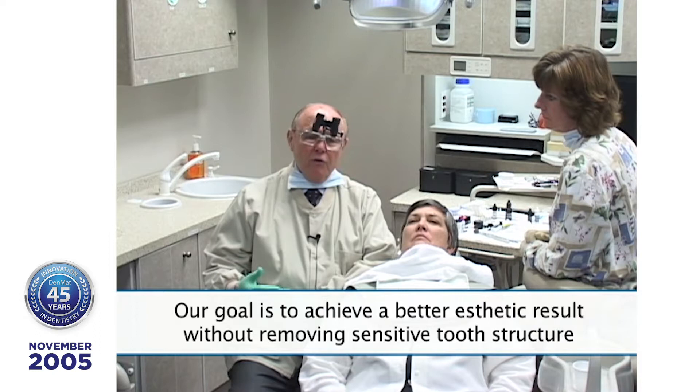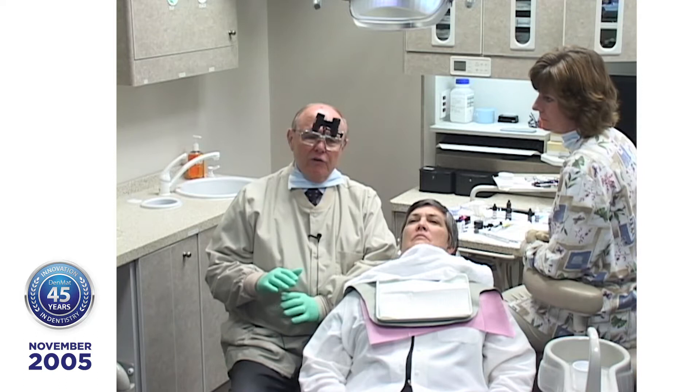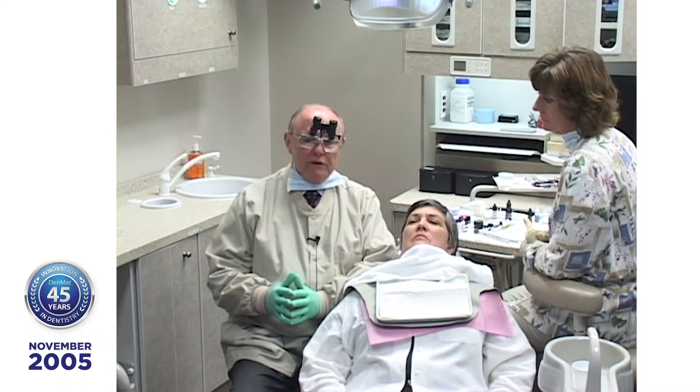When you're working with the Lumineer system, you don't have to remove even a half millimeter of tooth structure. On most patients I'll remove some enamel, but it's cosmetic contouring. The guide I have is: what I remove makes them look better, so even if we never went forward, they would look better. You take away what is in the best cosmetic interest of the patient, not because you're going to build something up.